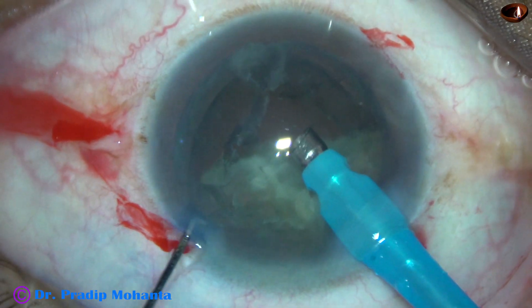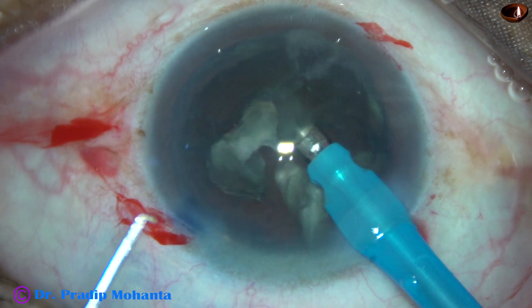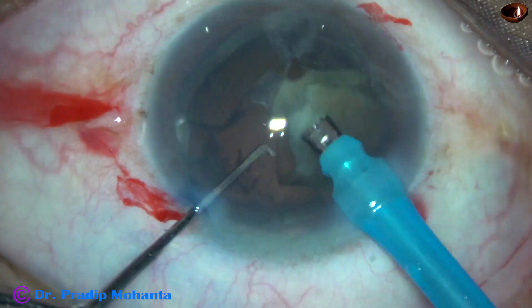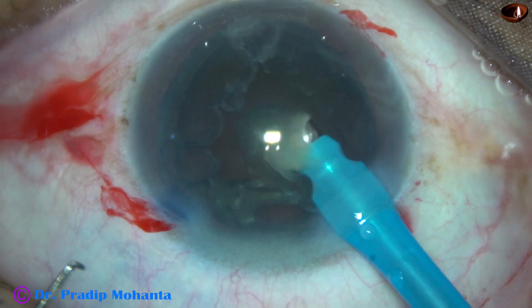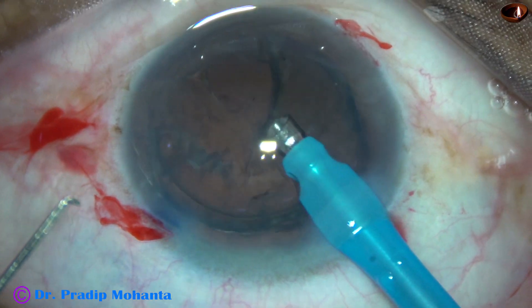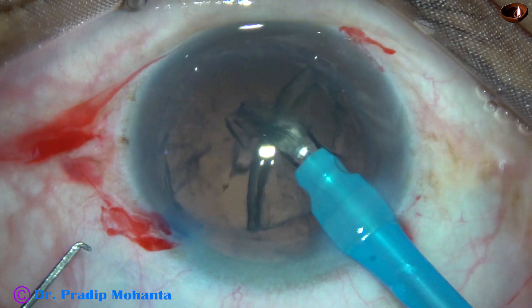If you try to make a trench to divide-and-conquer or stop-and-chop, you are going to spend a lot of time — more time in the anterior chamber. But when you do direct chop, you save a lot of time and it is safe once you learn the trick. The trick is you must be able to hold the nucleus very firmly at a thick place and use your chopper to divide the nucleus into fragments.